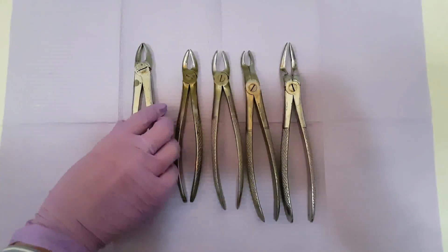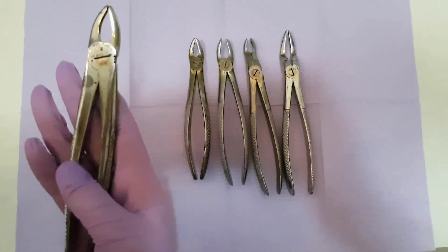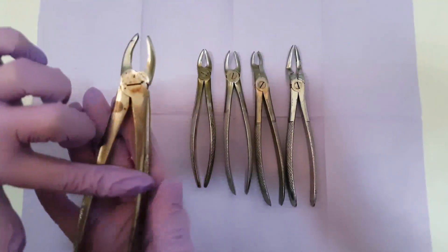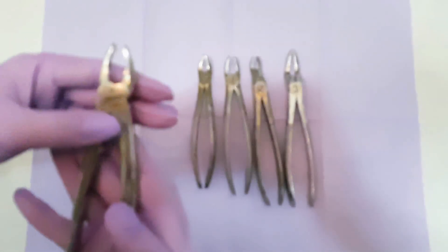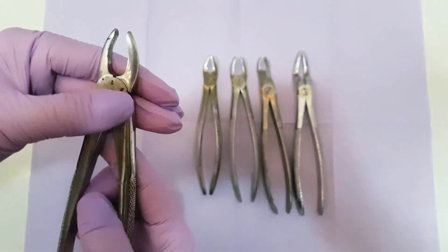First I want to start with showing you the upper frontal forcep. It has two working handles that are connected with the working beaks with one hinge. This is one handle and the other handle. This is the hinge that allows the forceps to open and close.